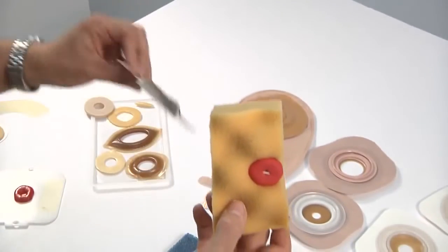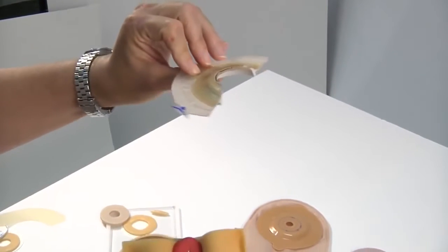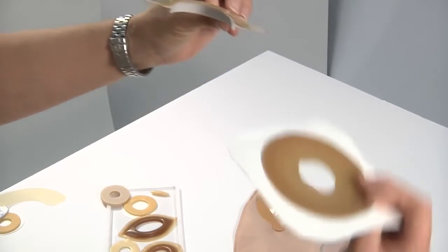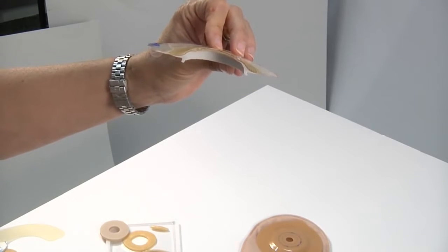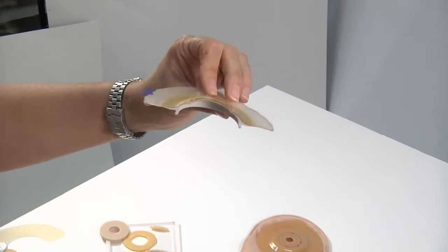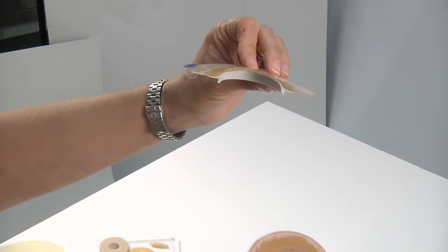So convexity, when you look at the back of it like this, I've just taken a convex barrier here and cut it in half, you can see that there's some degree of protrusion. It's quite different than when you look at the back of a flat flange. And as I said, all of the companies make differing degrees or levels of convexity so that you can match the right one to what your patient's requirements are.